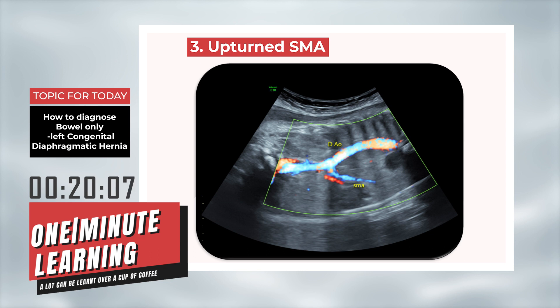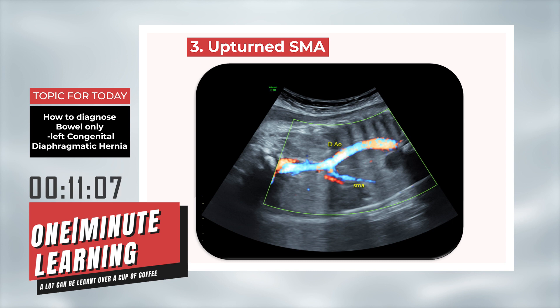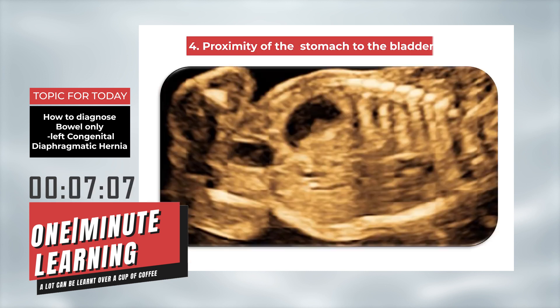The third clue would be: if you try to identify on a coronal section with color Doppler the superior mesenteric artery, you would realize that it is following faithfully the bowel up into the thorax — so you would find what is called an upturned superior mesenteric artery.